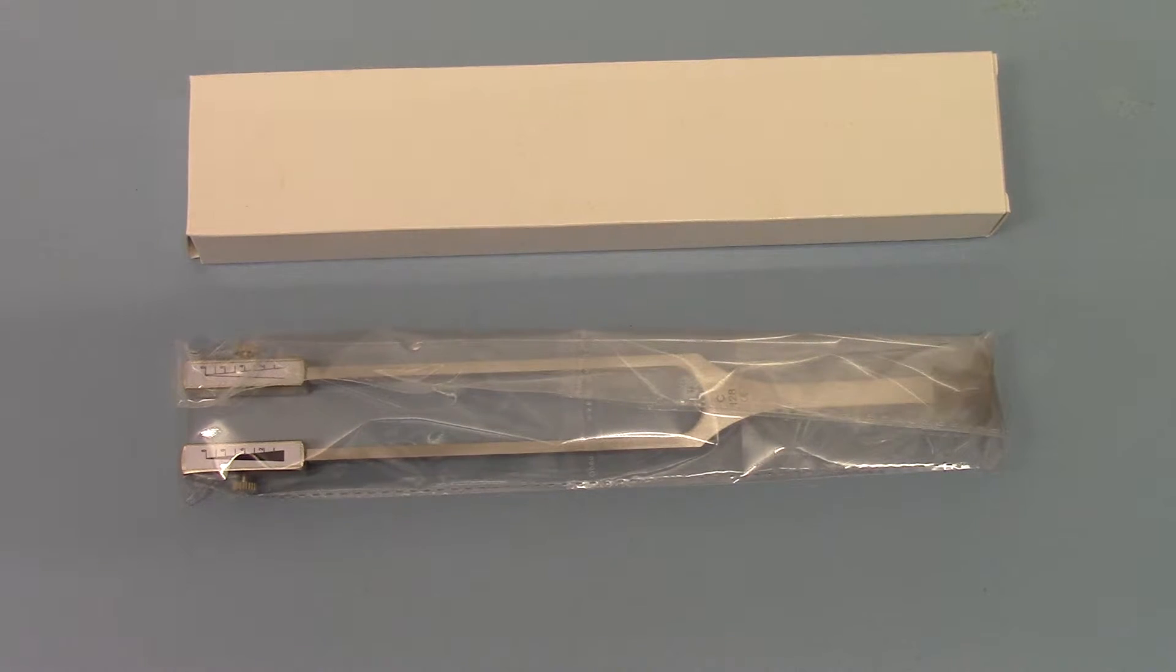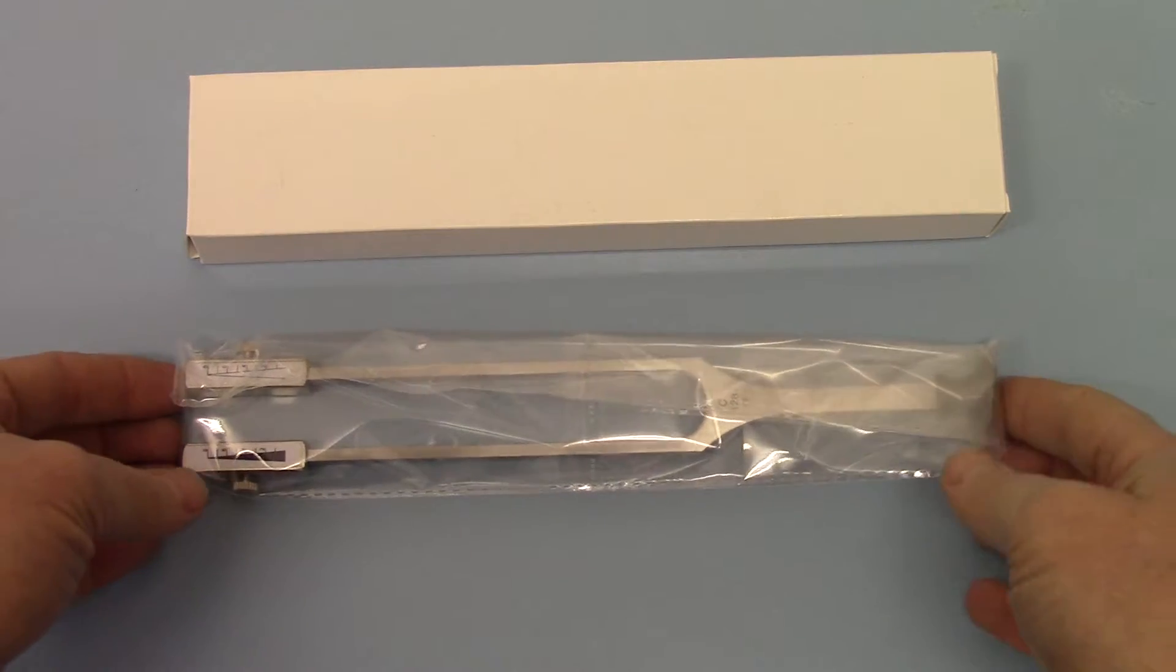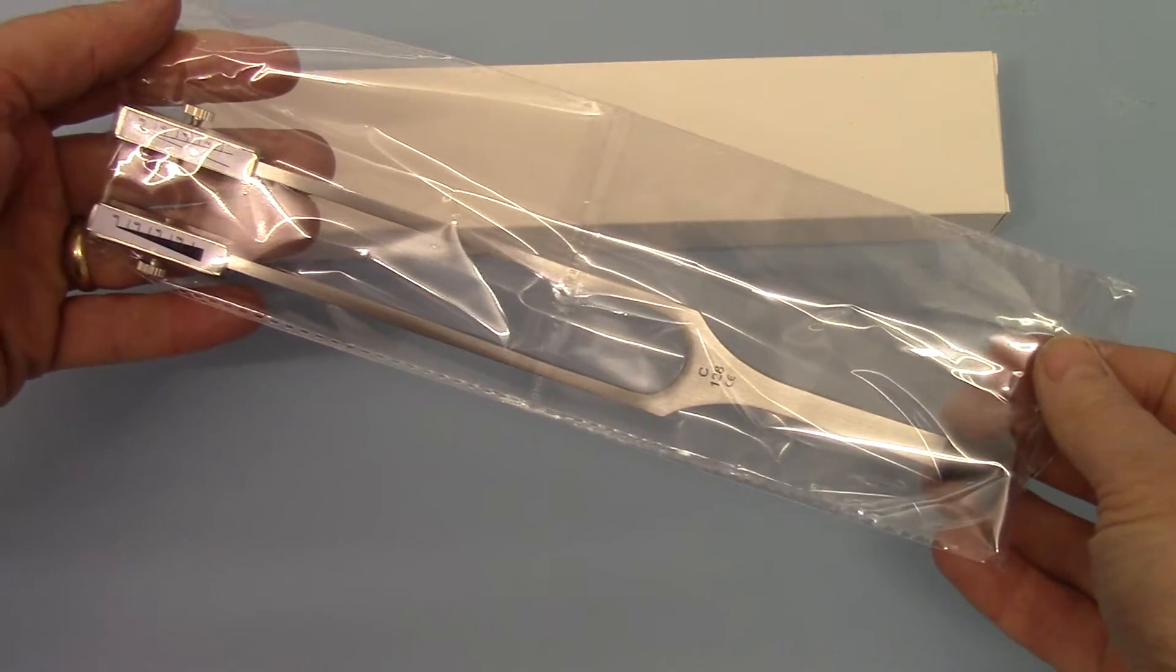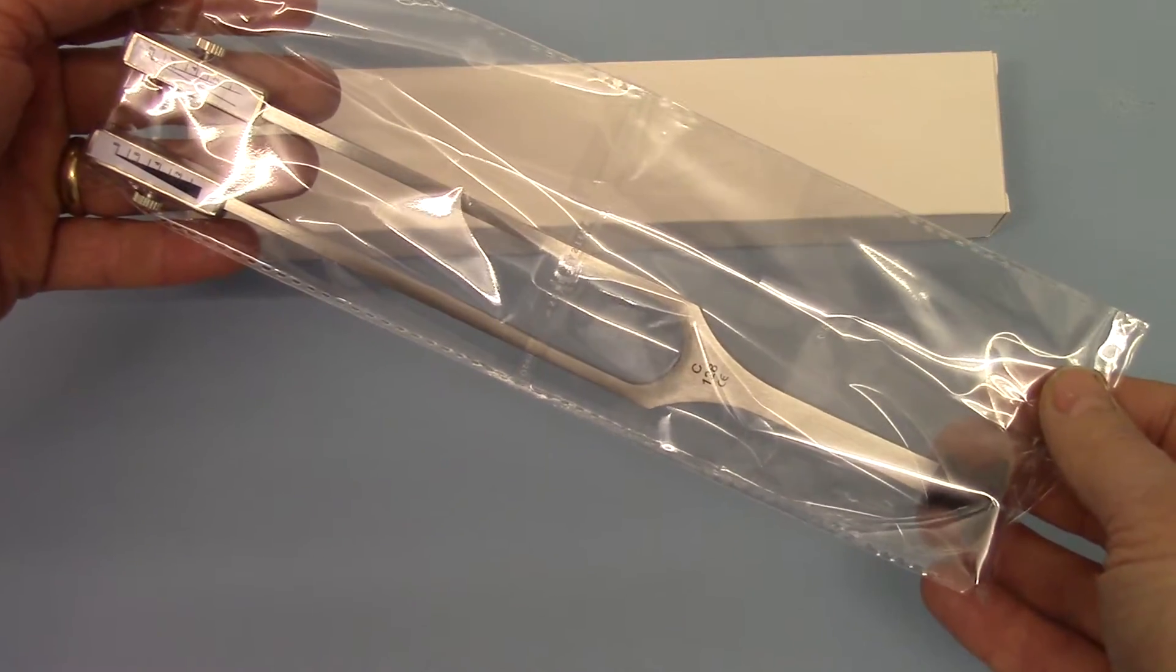Welcome to this product demonstration video of the Rydell Cifer Tuning Fork. The packaging is demonstrated here. It comes in a white generic carton box and then the actual fork is wrapped in this protective cellophane just to keep it in prime condition until it is delivered to you.